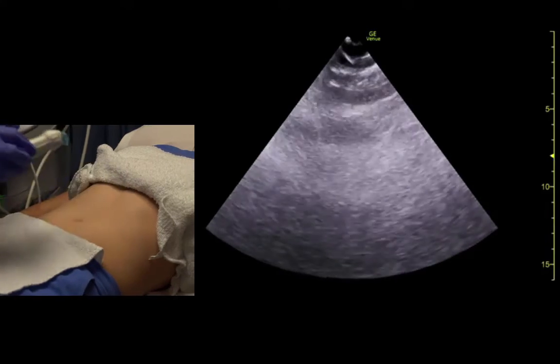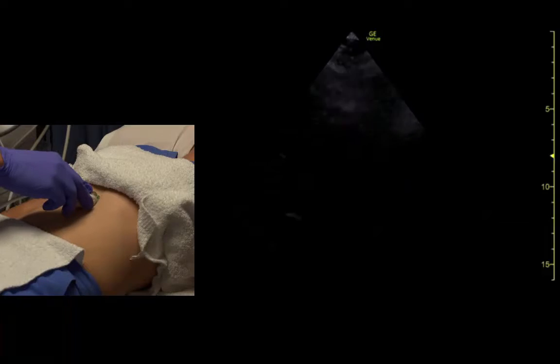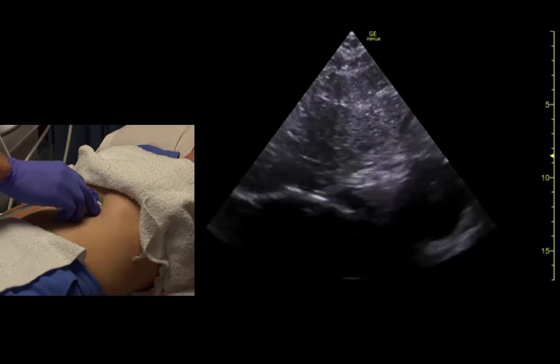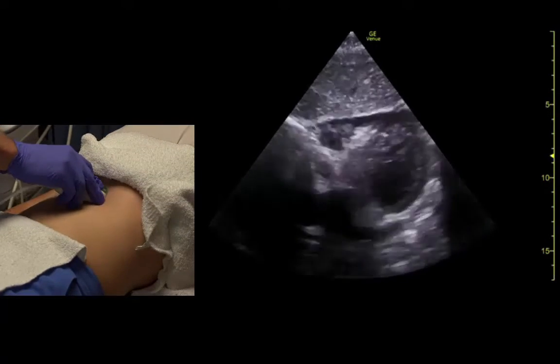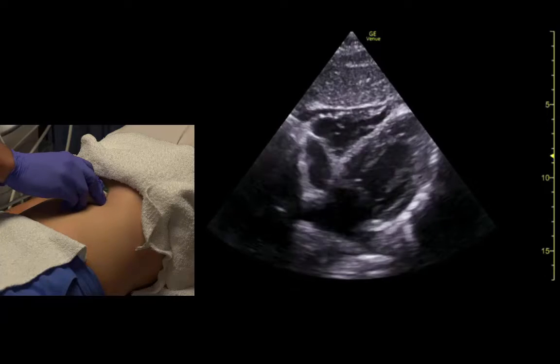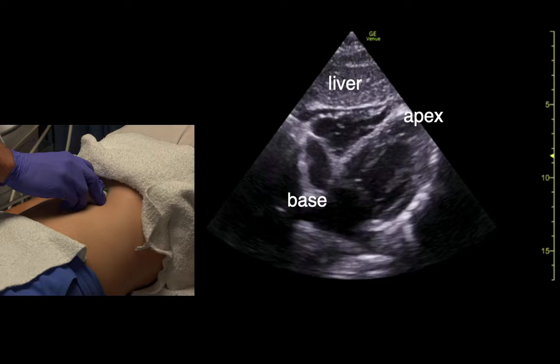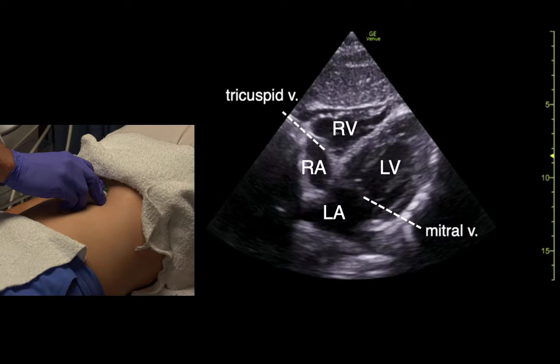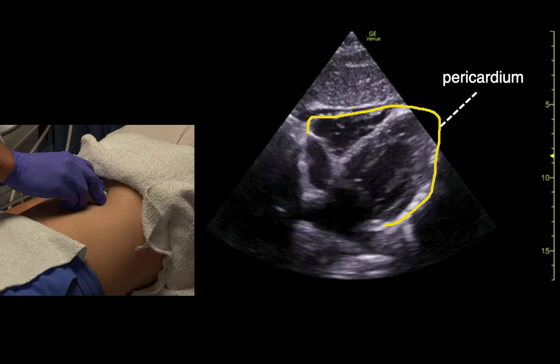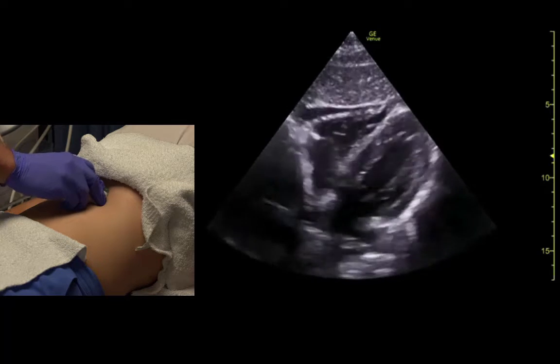Let's do the sub-xiphoid heart. Indicator is towards about three o'clock. We come under the xiphoid, and we'll ask her for a big breath and hold. We get a pretty good view of the heart here. Go ahead and relax.